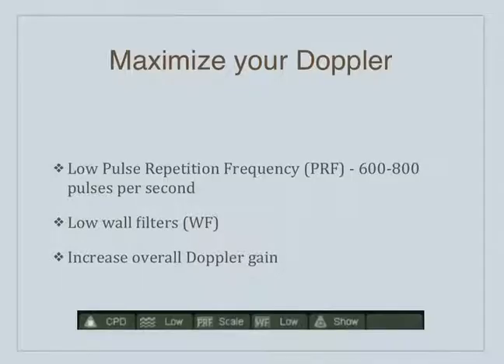We talk about Doppler quite a bit when it comes to the testicles, and this is where I find it most useful. There's the pulse repetition frequency, or PRF. The lower the PRF, the less pulses the machine is sending out, which means it's spending more time listening than sending. When you're listening more, you're more sensitive. So the lower the PRF, the less talking, the more listening, and the more sensitive the machine is. That's a situation where you really want to lower that pulse repetition frequency down to the 600 to 800 range.